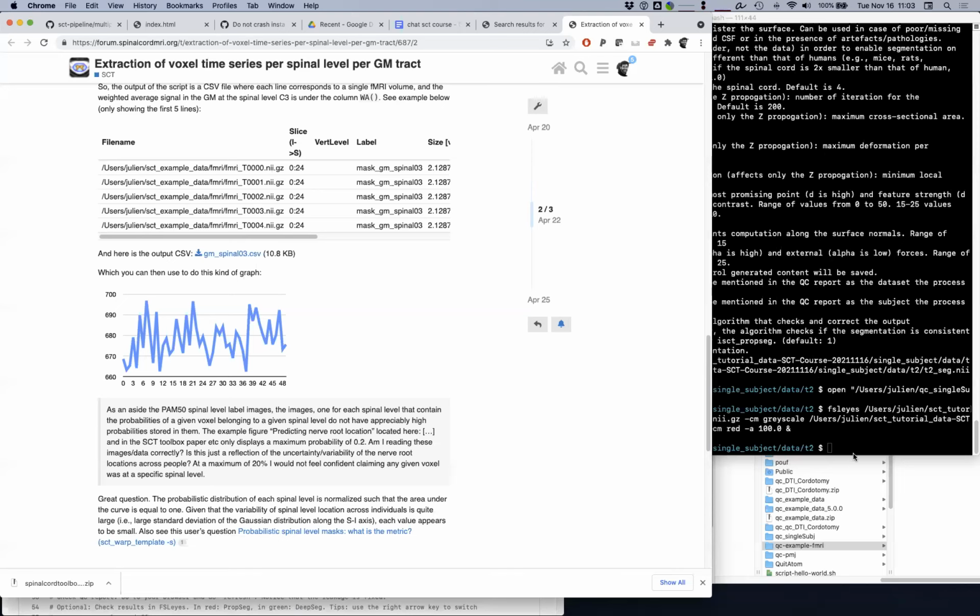So some questions about the segmentation. In the case of traumatic spinal cord injury, it is difficult to distinguish the tissue from the CSF, getting out the shape of the high signal of the remaining tissue on T2-weighted images alone.